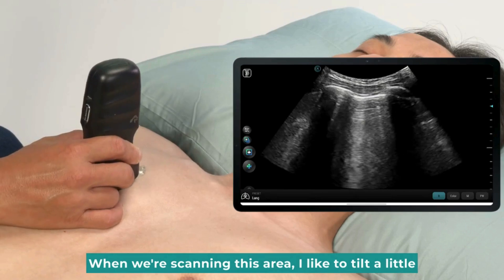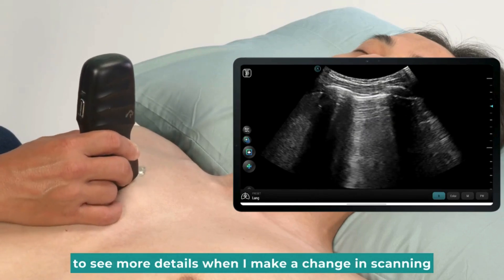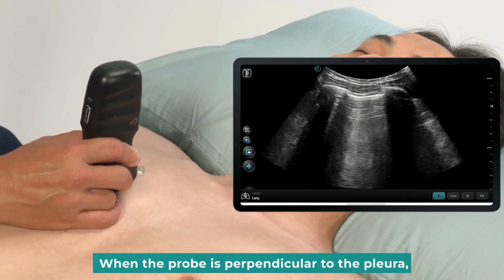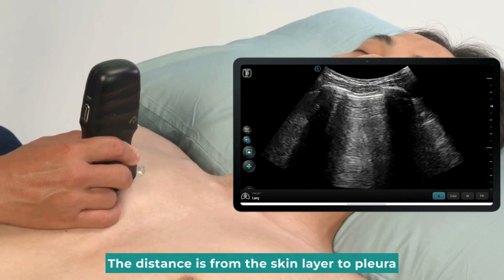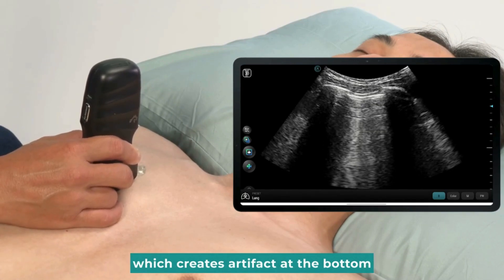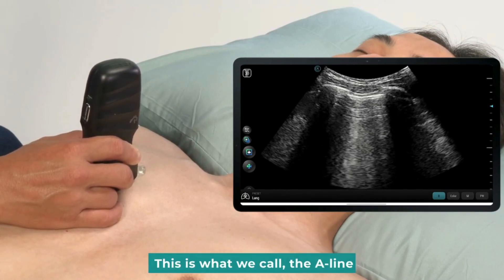When we're scanning this area, I like to tilt a little to see more details. When the probe is perpendicular to the pleura, the distance is from the skin layer to the pleura, which creates an artifact at the bottom. This is what we call the A-line.